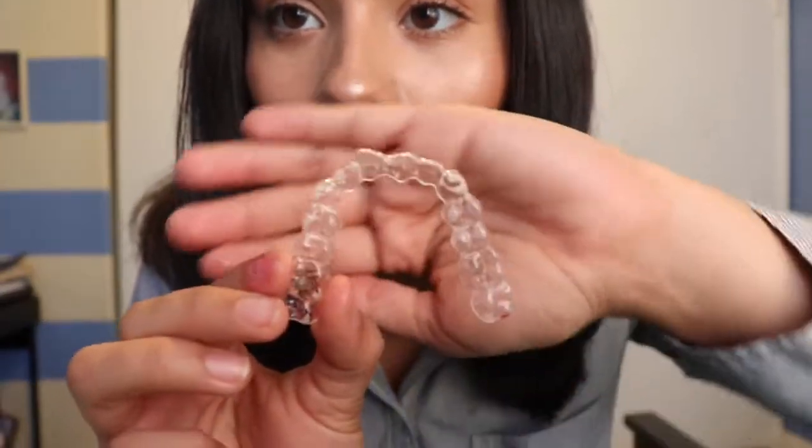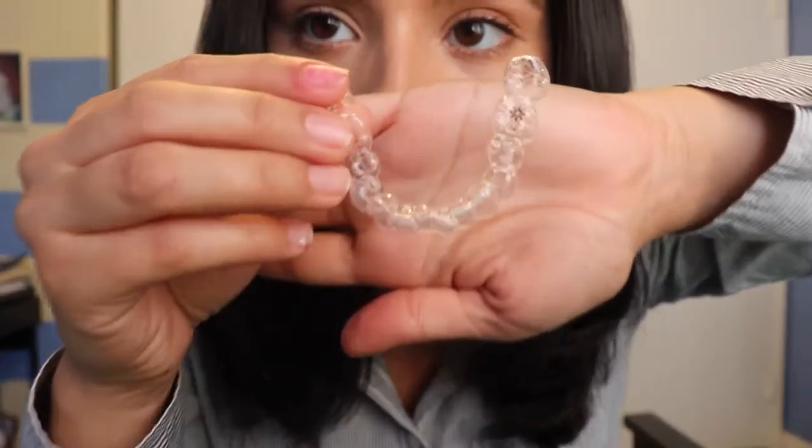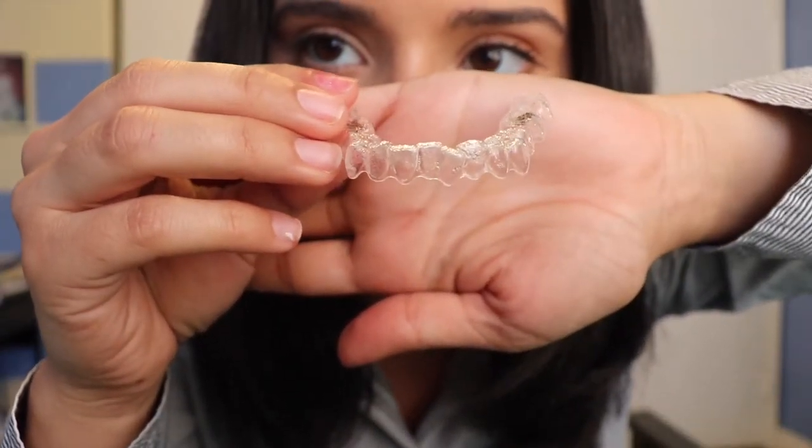I got them, and now I have my Invisalign on — I'm so happy. I don't feel pain. It is a little bit tight, but that's normal. I only have to wear them 22 hours a day. The extra two hours are for me to take them off when I eat and when I brush and clean my teeth. I just want to show you guys how crooked my teeth are — look at that. Do you see how crooked they are, my bottom teeth? I can't wait to see the results as I go. I hope you guys keep up with it and see the results as I go.